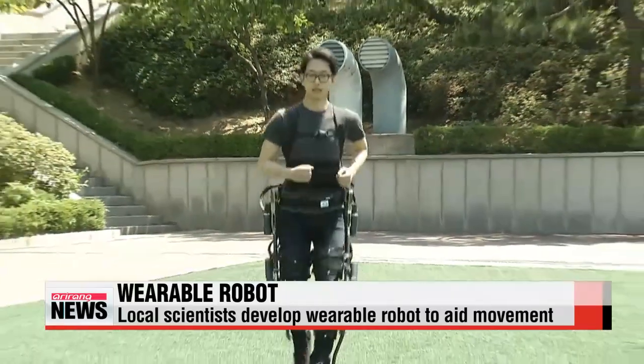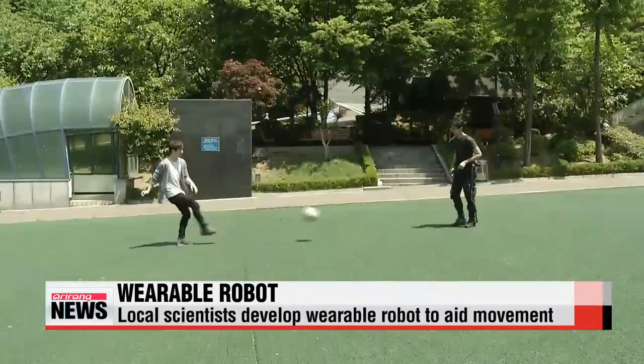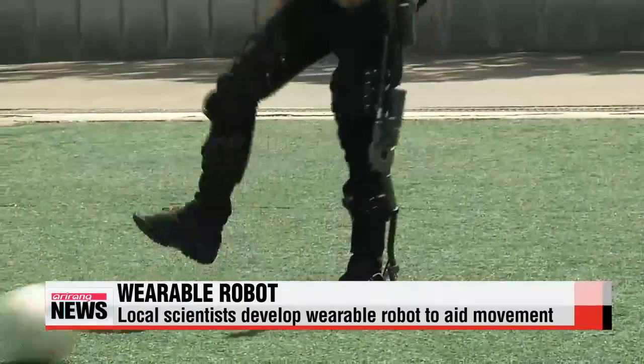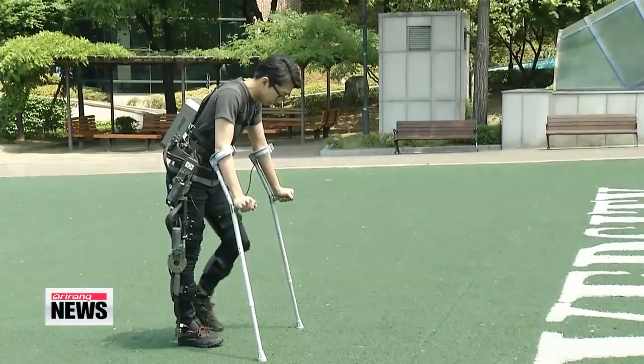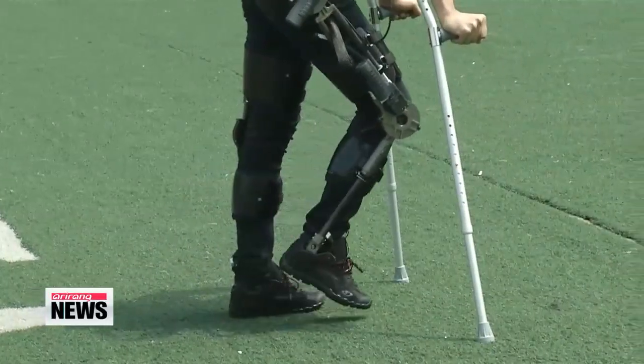And that's just one of two-thousand calculations the robot can make in a second. Whatever the user's intention, our robot can add strength to all movements precisely and without resistance. This new machine is expected to be particularly helpful for patients with leg injuries and disabilities.